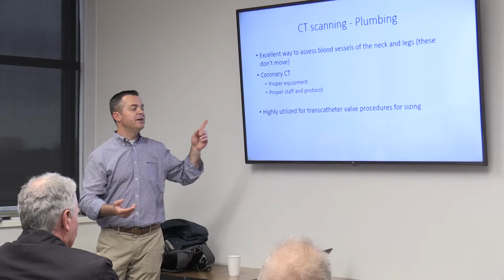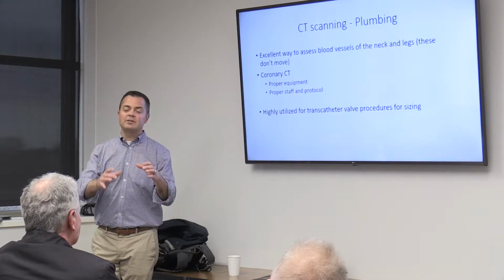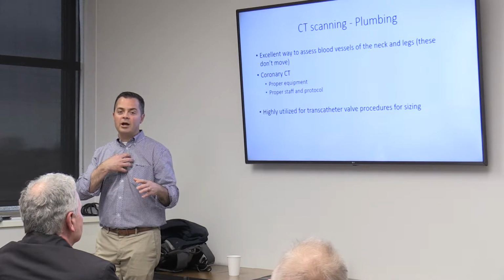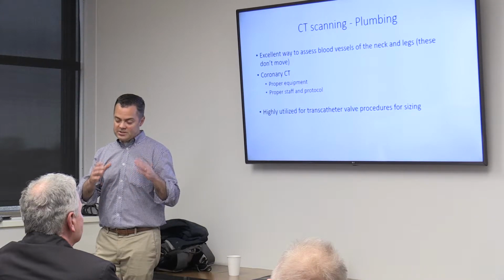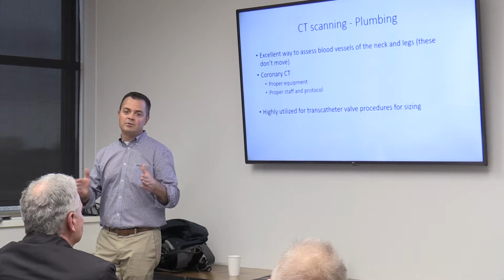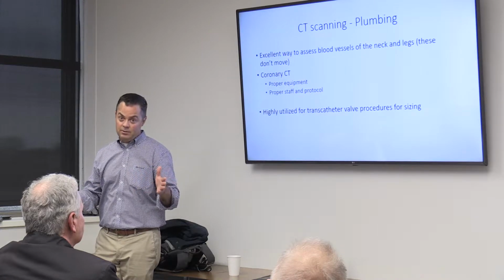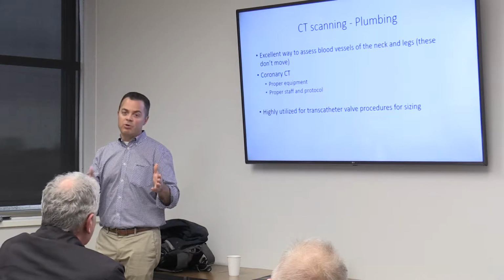Now, this is not a test for everybody, but it is a test that we can selectively utilize in people where we're worried about blockages of their heart arteries. We can take a scan of your heart, and in one beat, we can acquire pictures that will show us your heart arteries with clarity that would blow your mind.